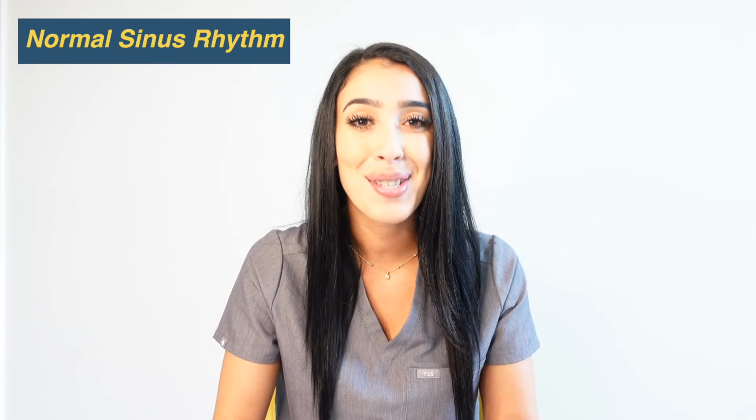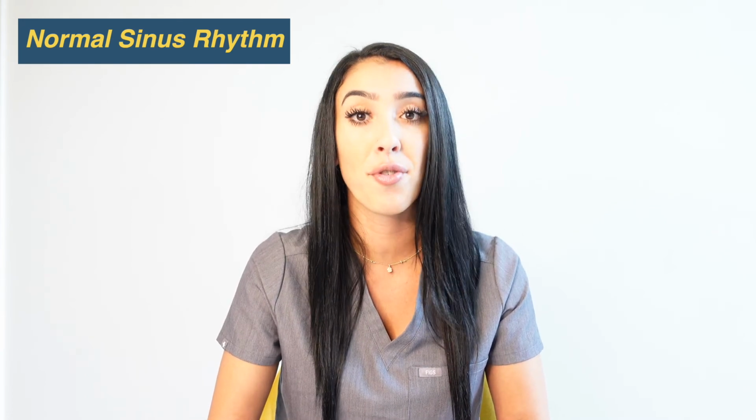Now, let's review the causes and treatment plans of these rhythms. Now, normal sinus rhythm, it's completely normal, right? So no treatment is going to be needed other than continuing to monitor the patient for any changes. Patients in the hospital are going to be on the monitor, especially if they're on a telemetry floor or have a tele order, so we want to keep looking out for any kind of changes.